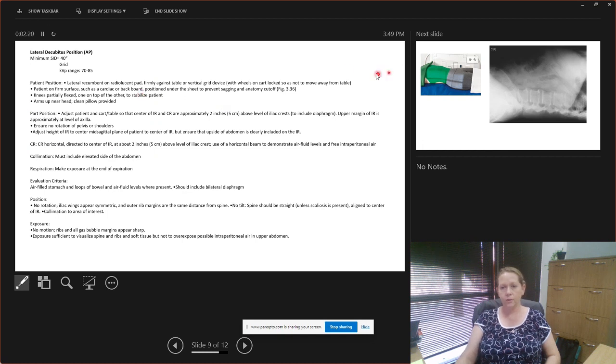So the actual IR plate for this image is on her left side. If I could get this thing to go, that'd be cool. Oh, and the grid device has to be locked so it doesn't run away. And let's see. Oh, okay, there we are.